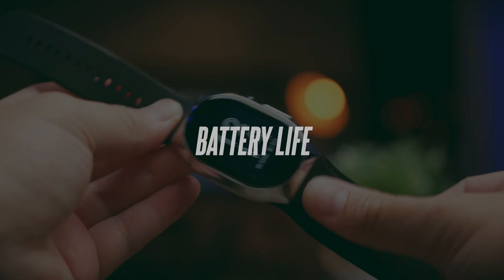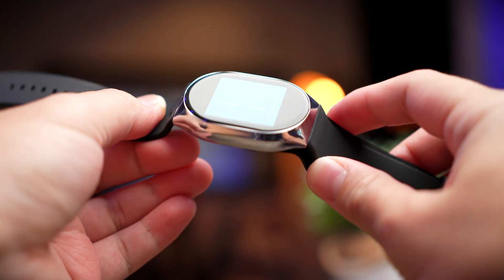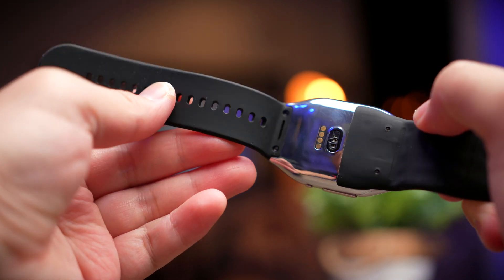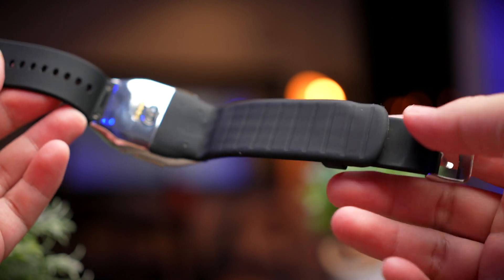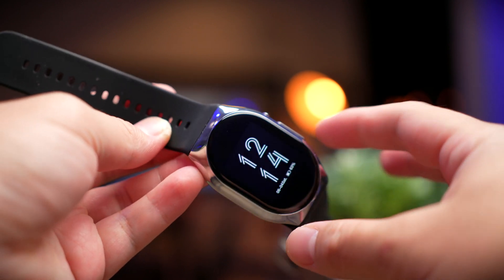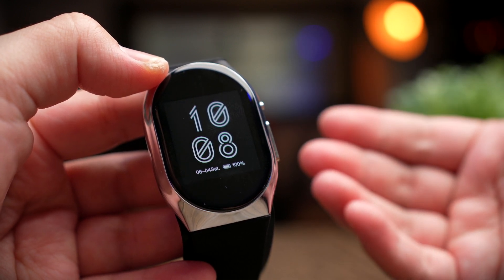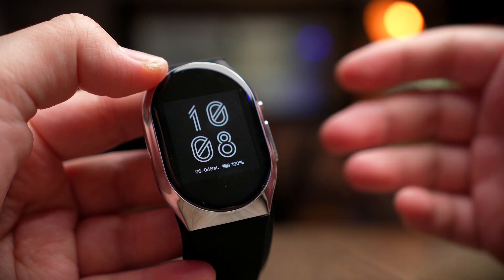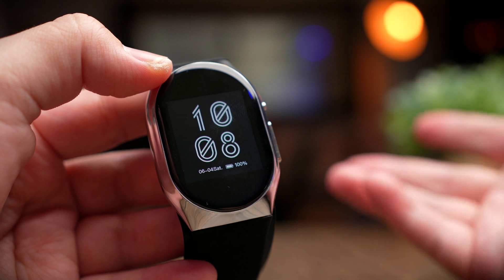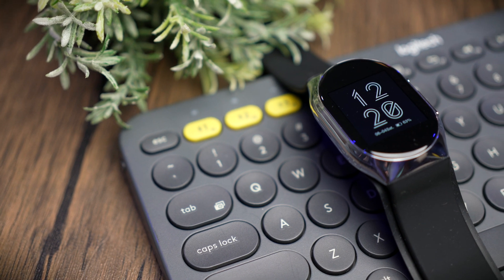Now for the battery life, which I have very mixed experience with. YHE rates the BP Doctor Pro at seven days of normal usage, but I believe this is without extensive continuous BP testing. When you use BP tracking frequently, the battery drops quite quickly. I tested the watch on standby on my nightstand and the battery lasted about three days. With notifications and constant heart rate testing, it's a watch you pretty much have to charge every day.